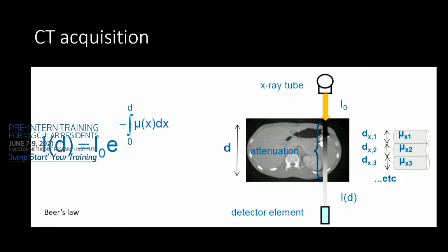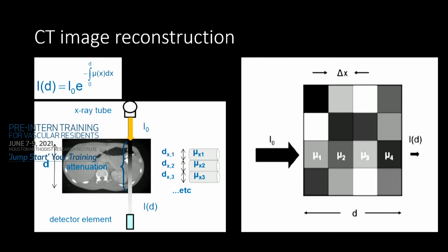And that can vary depending on what tissue you are looking at. For example, if you have air in the stomach, that's not going to absorb a lot of photons. Whereas, for example, a rib here, or in this particular case, if there was a spine here, then that's going to absorb more photons. So the absorption coefficient, what is called the attenuation coefficient, is what you are seeing as this mu, which is the attenuation coefficient for individual tissues. I'll come back to this in a second.